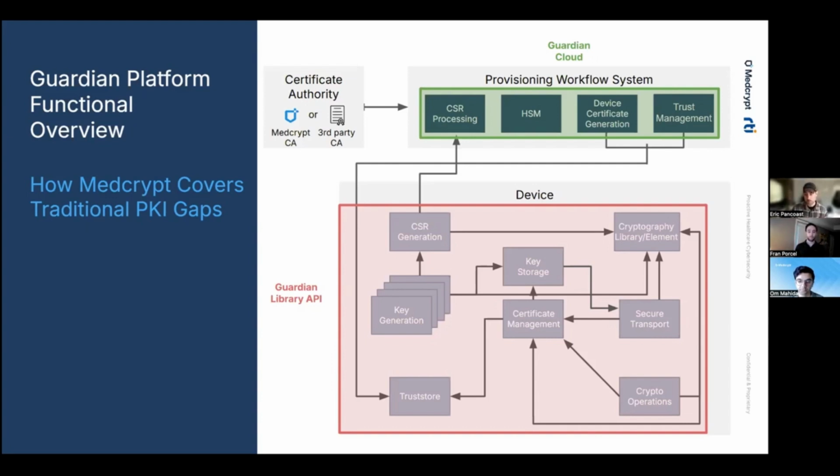So the Medcrypt Guardian solution is a profile-driven cryptography abstraction. So engineers don't have to worry about setting up and maintaining all of this infrastructure or interfacing with crypto libraries, hardware, OpenSSL, WolfSSL, Libsodium, HSMs, or crypto elements. That's all abstracted and handled by the Guardian ecosystem.